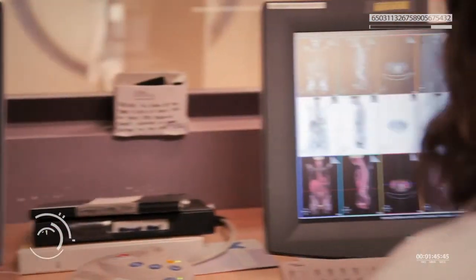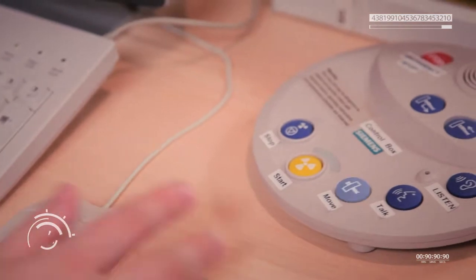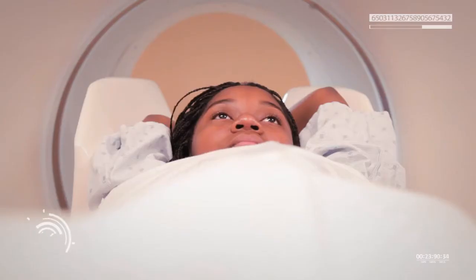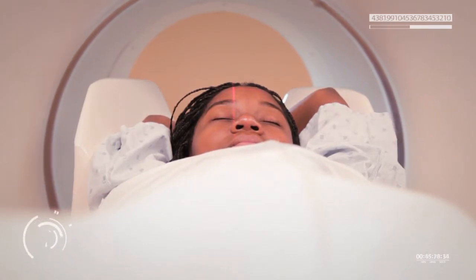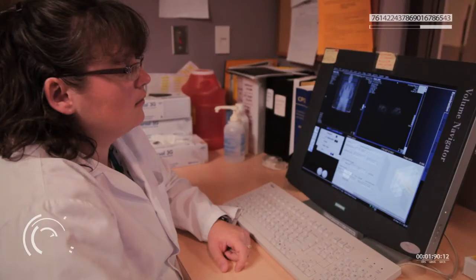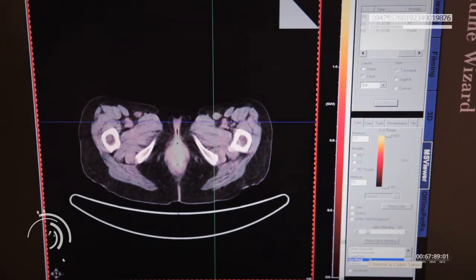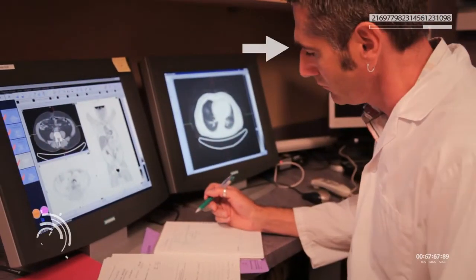Once I was positioned properly, she went to a control room and slowly moved me into place. It was a little cramped inside the machine, but it was good to know the technologist could see me and talk to me from the control room. The whole scanning process takes about half an hour. When it's done, computers create 3D images of that data. The technologist would check the images to make sure they are clear and send them to the reviewing station for a doctor to review.